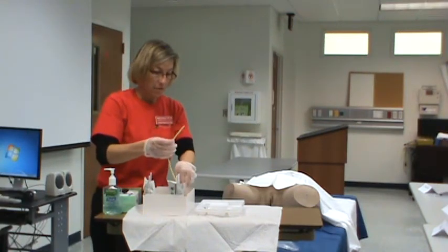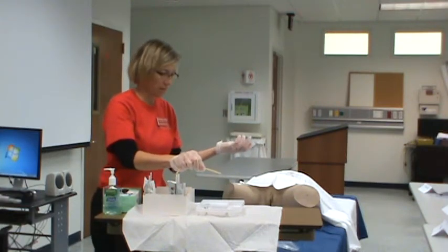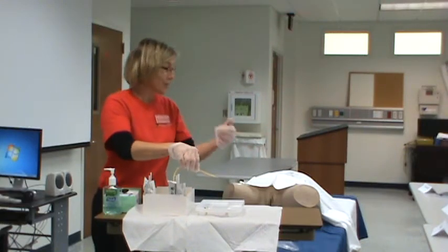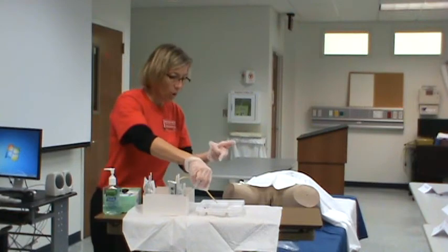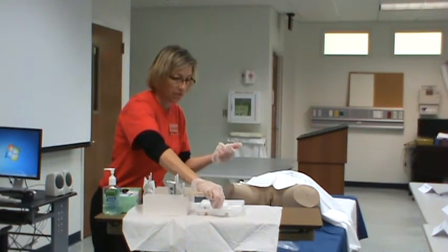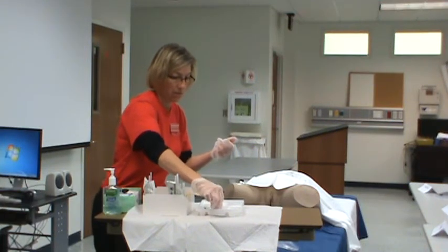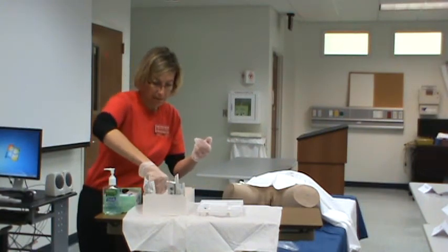And then in the clinical setting, this is where you'll lube with the lube that's in the kit. For us and for SPD, this is where your instructor will be ready with the lube like Dr. Robinson just had, or we'll put it here on the kit. Either way, it's going to end up working out fine. So you give a generous amount of lube, because that's what we do with the mannequins. And then I put it back in my kit.